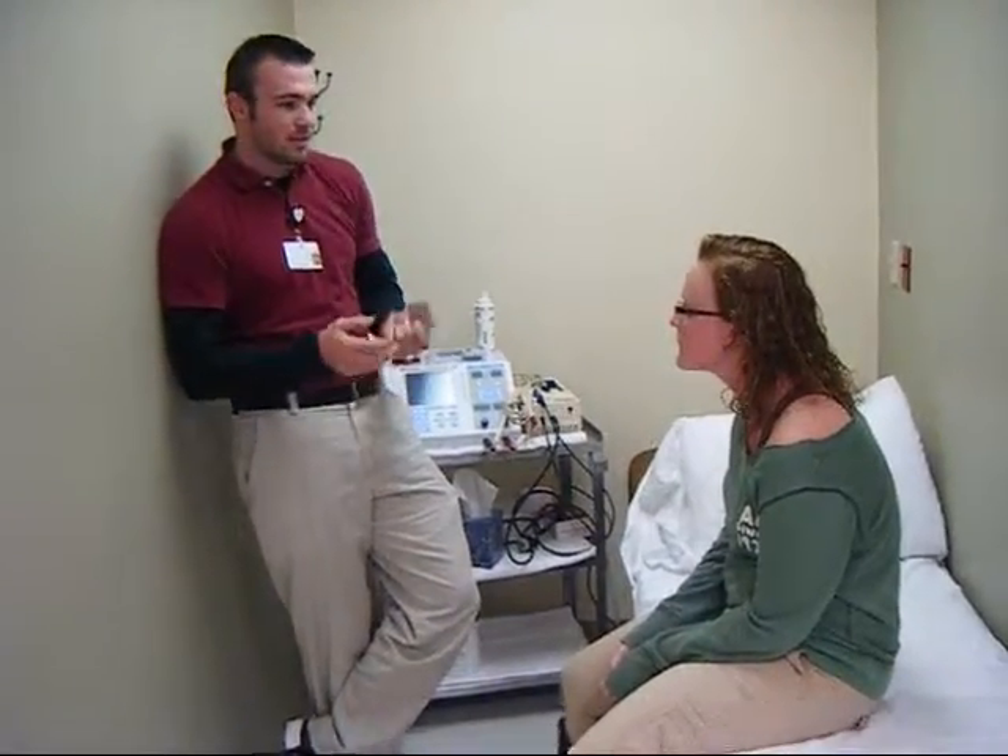So it's not that it cures pain, but what it does is it relieves the pain from occurring, and it lasts anywhere from 20 minutes to four to five hours. To put this on for 20 minutes and have four to five hours of pain relief — it's definitely well worth it.